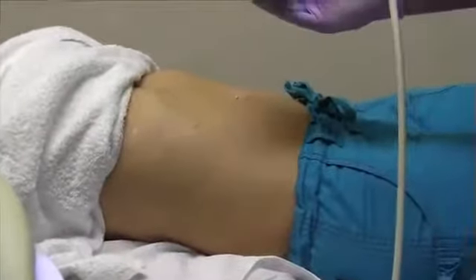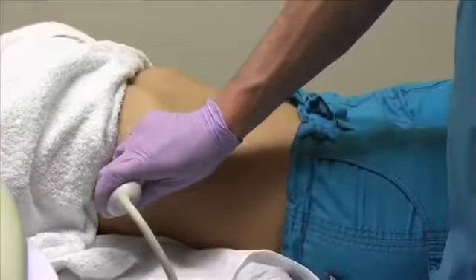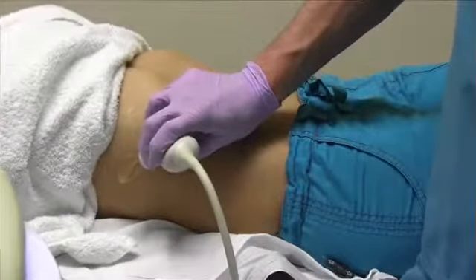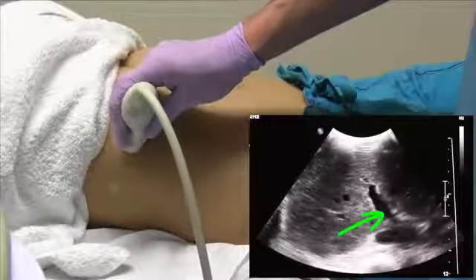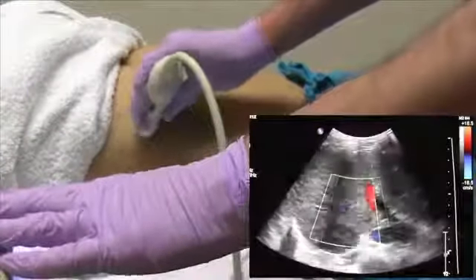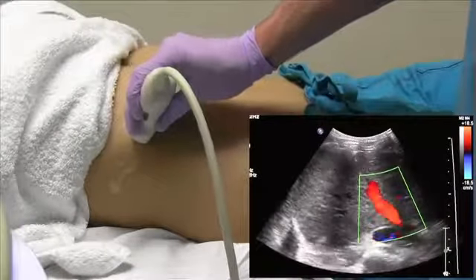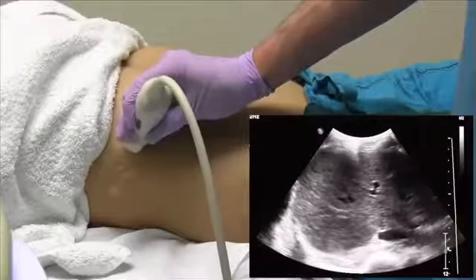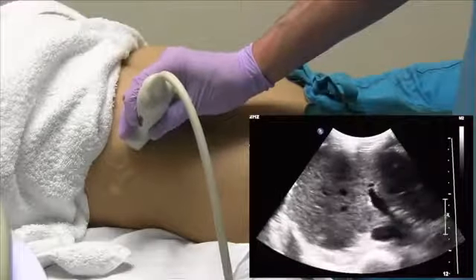Okay, another window we can use to get the porta hepatis and the CBD is this intercostal right window again. This is a good window for if you're going to do any pulse wave Dopplers, because usually the main portal vein sets up at about a 60-degree angle. So you get good color fill, and you have an accurate pulse Doppler measurement if you need it.